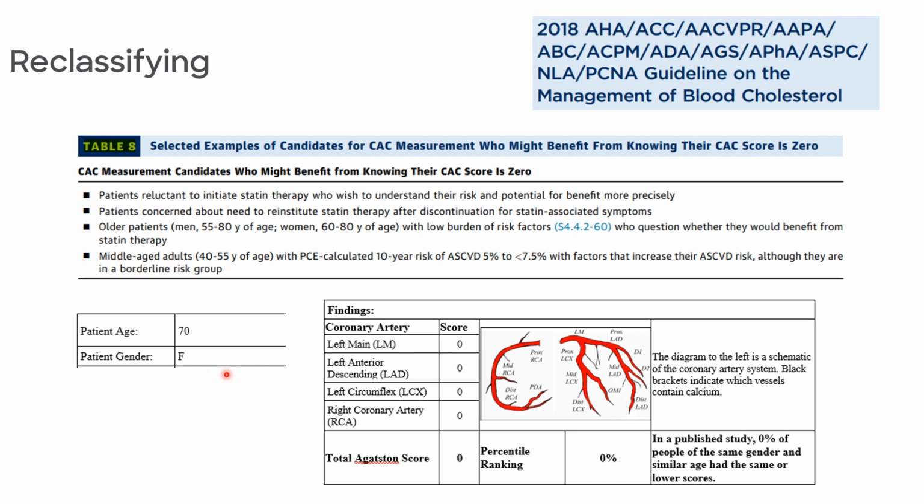If you've got a calcium score that shows plaque, it's a really good idea. If it's 0 at age 70, then it's pretty unlikely that you've been making plaque, at least for the last few years. It hasn't had a chance to calcify. And her score was 0. And she can make an informed decision.